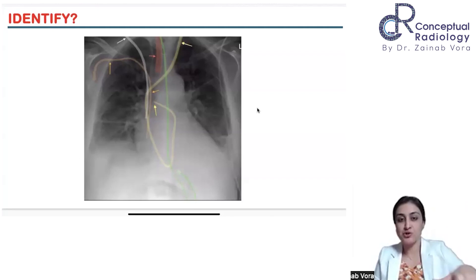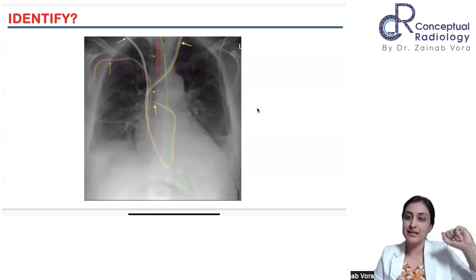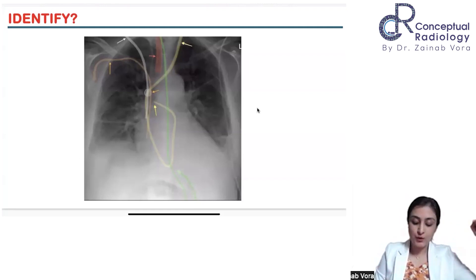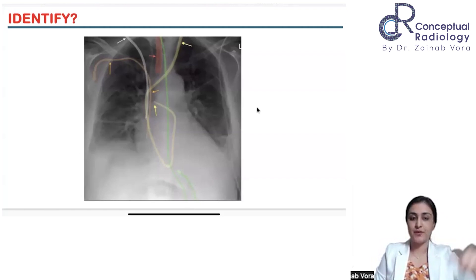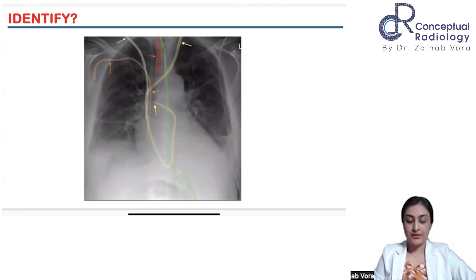The green tube is the NG tube. When we talk about the NG tube, we want at least 10 centimeters of the tube coiled inside the stomach so that it is not pulled out. So the key word for NG tube is 10 centimeters of coiling inside the stomach for it to be adequate. Now, what is the yellow line? This is not a central line.